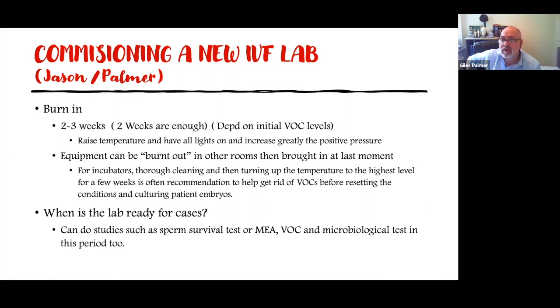So we looked at the VOCs in the air. Obviously, you have to flush out those VOCs. So you want a higher temperature than normal in a lab. You want overpressure. You want the lights kept on continuously.